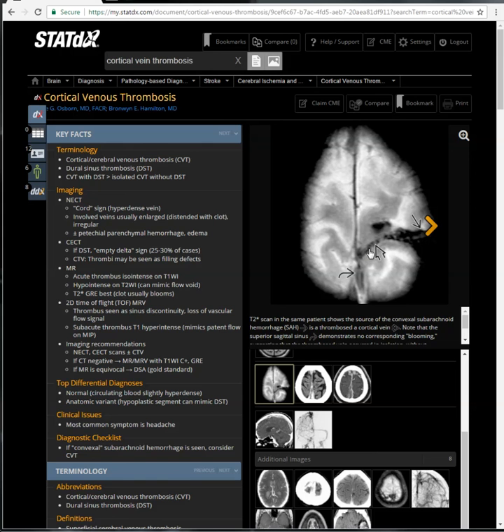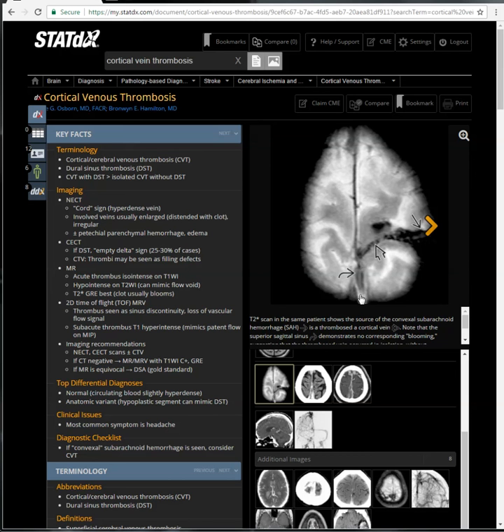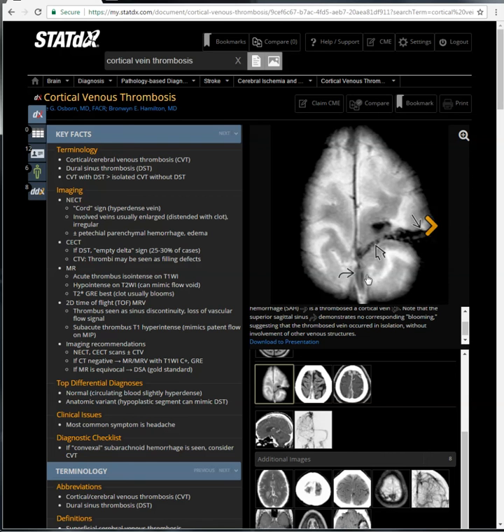Here you can see the clot, the tram-track, blooming artifact. Look at other veins — they are not that thick, not that black, not that tram-track-like. They are comparing the clotted vein with blooming artifact, and the superior sagittal sinus, which was not clotted and does not have the blooming artifact.